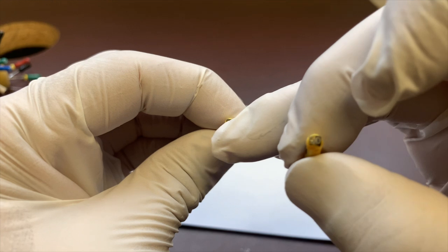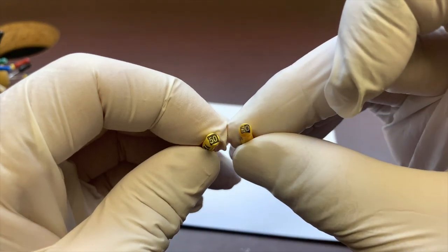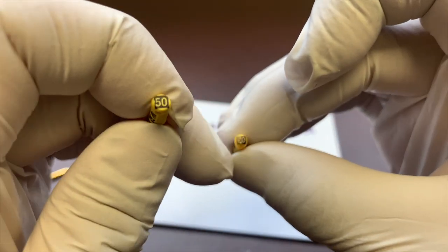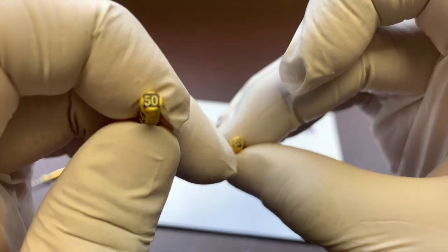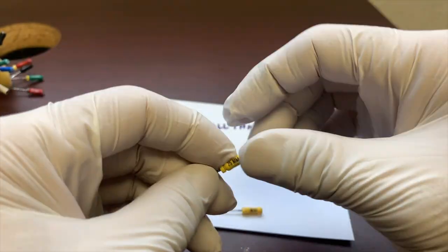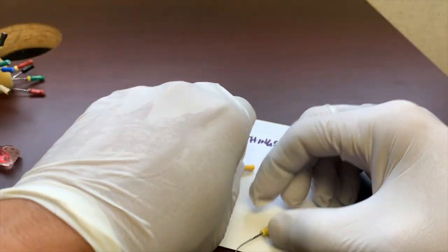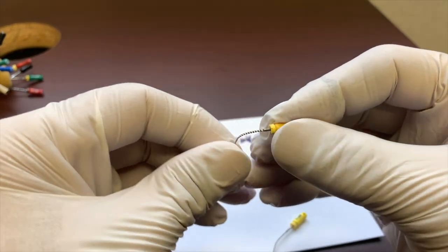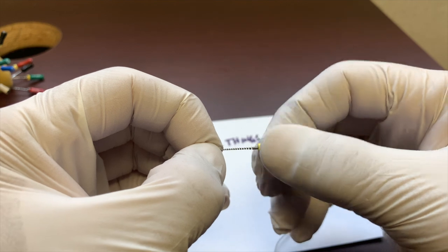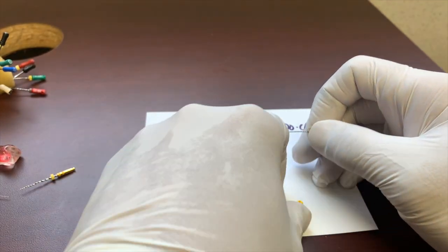This indicates the cross-sectional diameter of the file, which is a square in K files, and the handle indicator is black for K files. Nickel titanium is typically half black, half white. And look at the flexibility. Here, this is a 50 in the stainless steel. This is a 50 in nickel titanium. It's just incredible. It maintains its shape and I find it really effective using the balanced force technique to go around slight curvatures, which is what this is designed for.